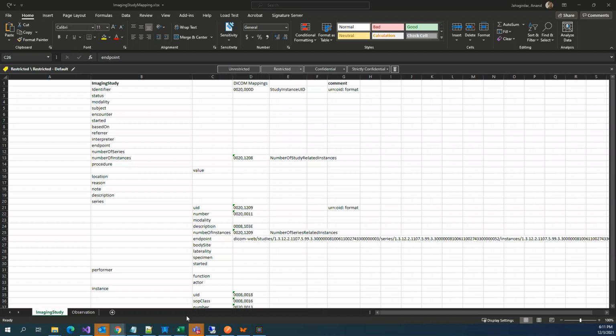Ideally, if you have a very good application which can combine these two things, it gets the image, it gets this SR which has measurements, and it enables you to draw that measurement on that image as well. If you have an application which can do that, you should be able to do it, because it also has the relevant links. But yeah, it's a big project.